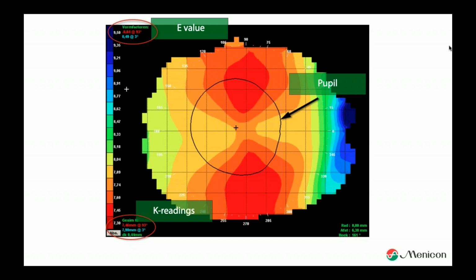On the other hand, and you already know it if you sit behind the topographer, I try to accommodate on the Placido disc. It won't work. It won't happen. It cannot accommodate because it's too close. So the pupil will become small and big, and it will affect the pupil size as well. So in my perspective, the pupil size is quite unreliable in a topography measurement. You have other tools for that in some topographers.